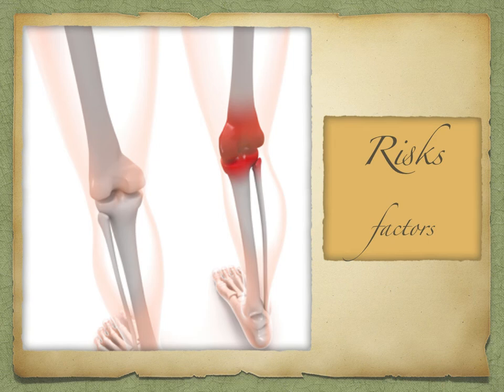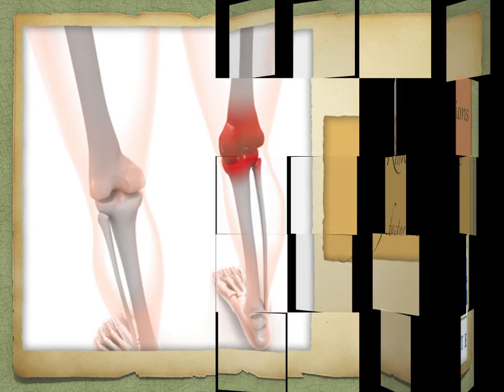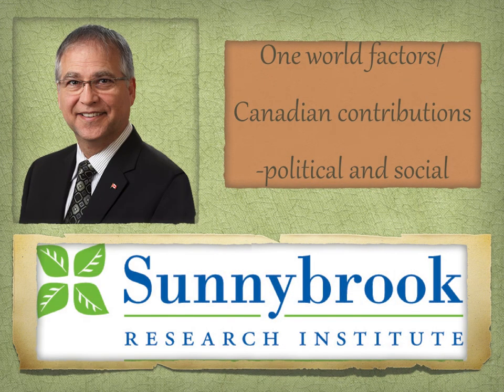The radioactive material should not cause much harm, thus larger risks are very uncommon. However, they can occur and might be rashes or swelling.